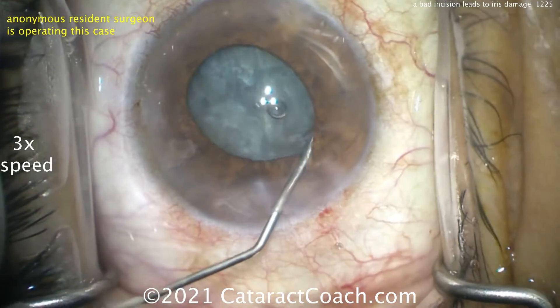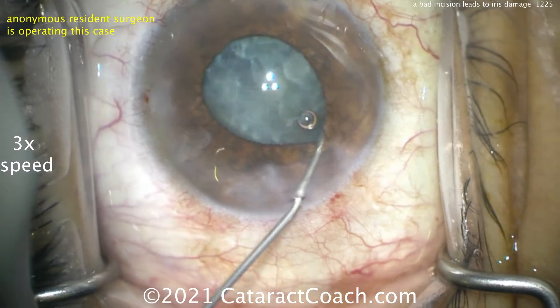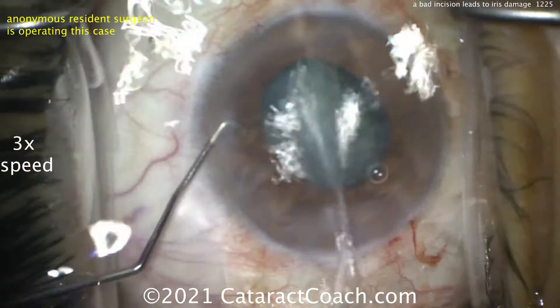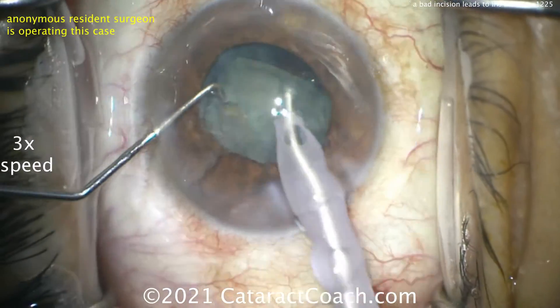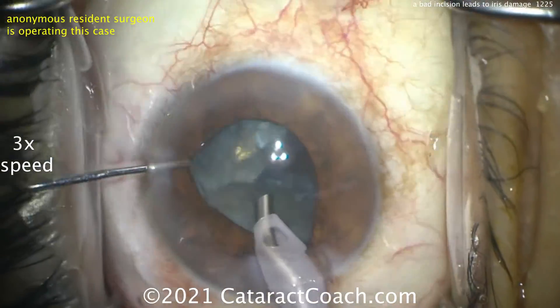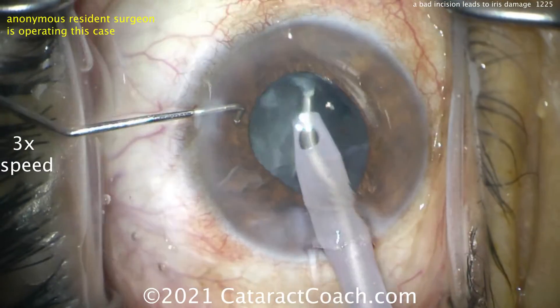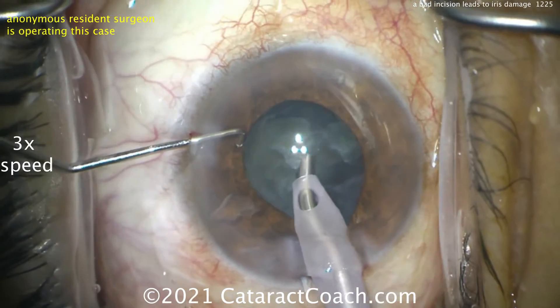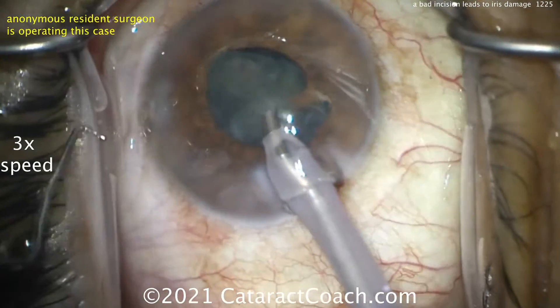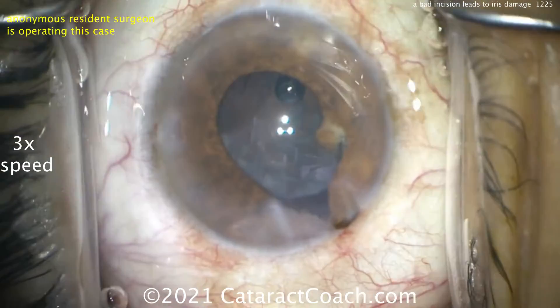Look — I already have iris prolapse. With that anterior chamber instability, the iris is going to prolapse more and more, and the pupil will become smaller and smaller. Getting the nucleus up out of the bag is a good move — now all you have to do is take it out without touching the iris. Look how the iris is peaked toward the incision — it's prolapsing out because of too much fluidic flow. Oh — we just nailed the iris there. Again, nailed the iris. Remember how delicate and wimpy that iris is.